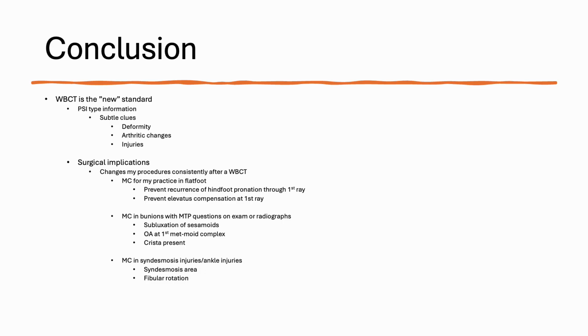And then it's also most commonly used in my practice for syndesmotic injuries, the distal ankle injuries, so fibular fractures, where we're looking at the syndesmotic area or the fibular rotation in comparison to the normal side, and I showed evidence for that as well. And then it's most commonly used for deformity correction of hindfoot and ankle pathology, so total ankle replacement, 3D printed models for Charcot, those 3D custom cages, all those applications that we previously talked about.